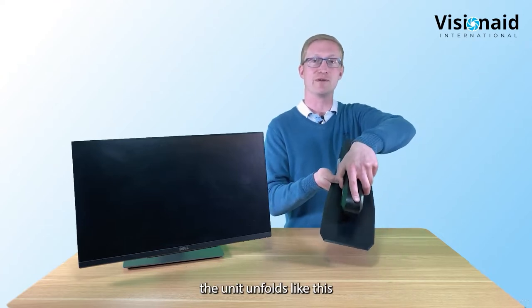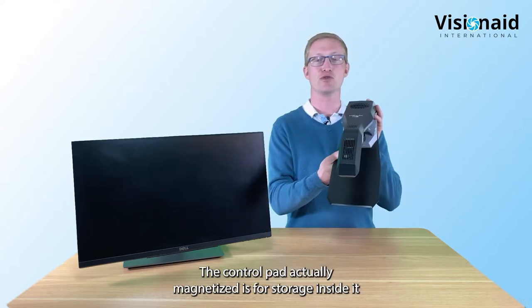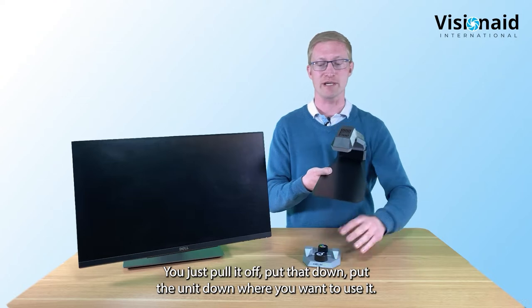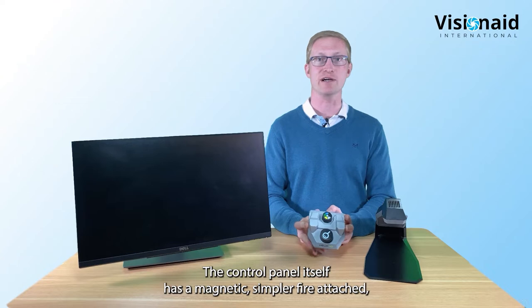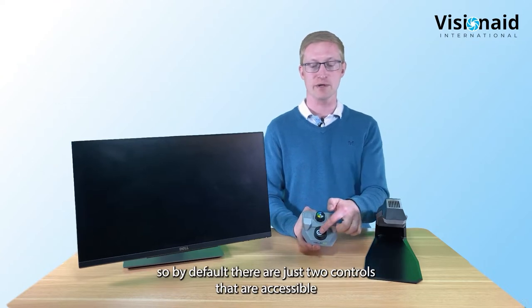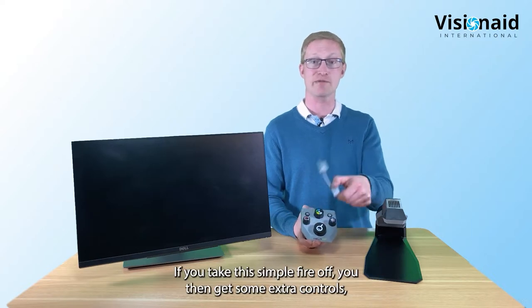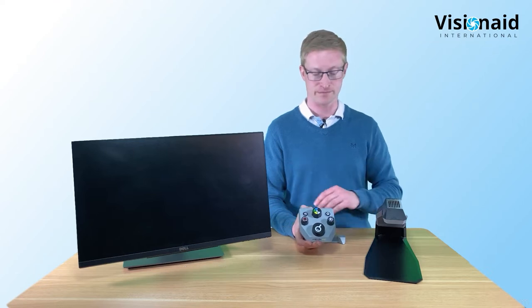The unit unfolds like this and the camera section unfolds like that. The control pad actually magnetizes for storage inside it, so it won't fall out. Just pull it off and pop it down. The control panel has a magnetic simplifier attached, so by default there are just two controls accessible: the zoom dial and the color dial. If you take the simplifier off, you get some extra controls which we'll run through later.